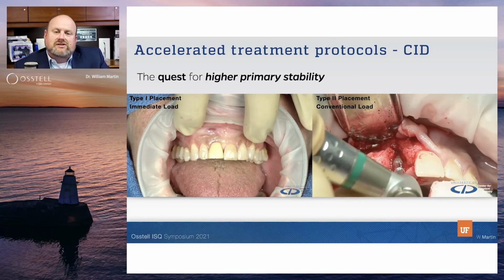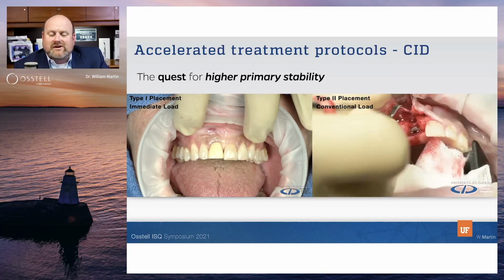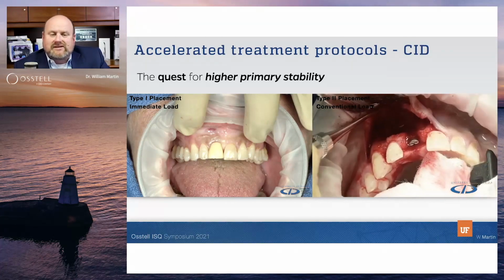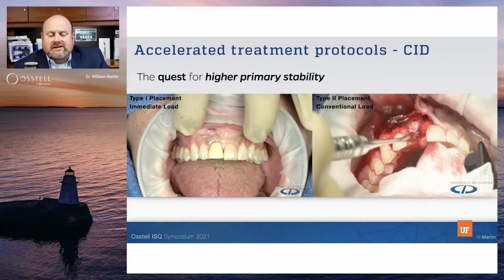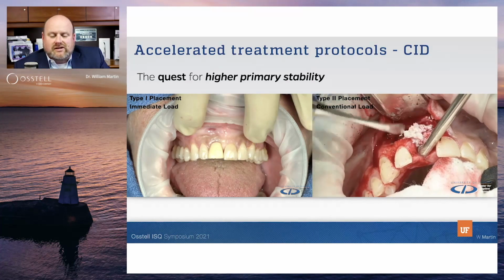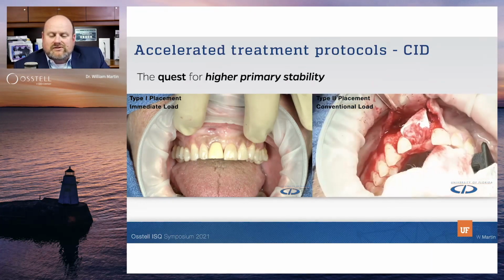So this is a CT-assisted template, right? We did the first guide drill through that, and then the implant was placed in that osteotomy, and then we're going through the process of doing a contour augmentation technique as published by Danny Buser and colleagues over the years. So this implant was tested as well for stability.